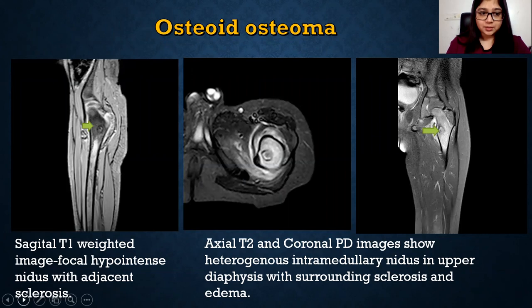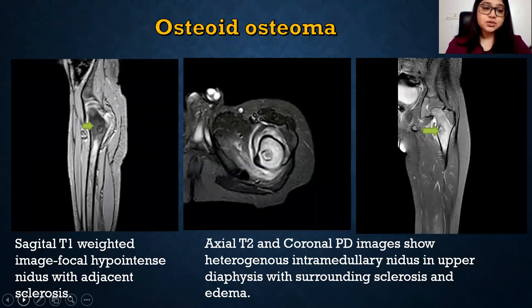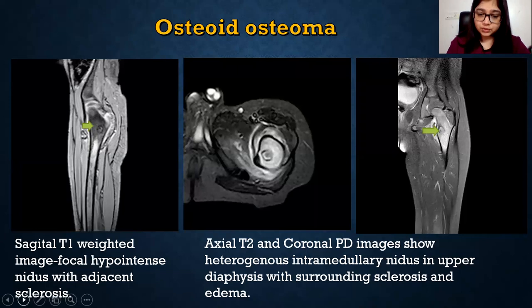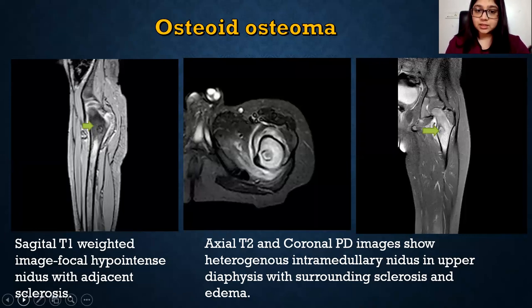A patient presented with night pain that was gradually increasing and relieved by aspirin. The sagittal T1-weighted image showed a focal hypointense nidus with adjacent sclerosis. Axial T2 and coronal PD images showed a heterogeneous intramedullary nidus in the upper diaphysis with surrounding sclerosis and edema. MRI is very useful to assess the edema pattern — whether intramedullary or perilesional — as edema is well visualized on MRI.